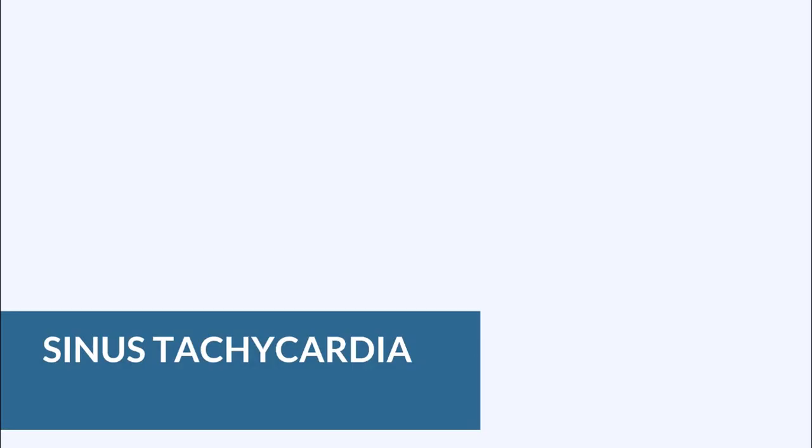Hey guys, in this lesson, we're going to talk about the characteristics of sinus tachycardia and the most common symptoms, some of the possible causes, treatment, and nursing interventions. We're also going to break down each of the steps to learn how to identify it on an EKG.